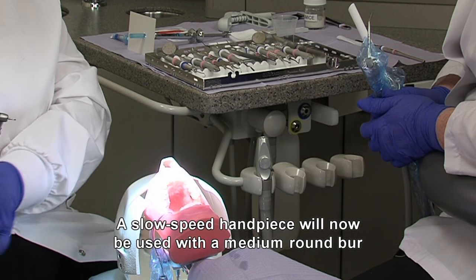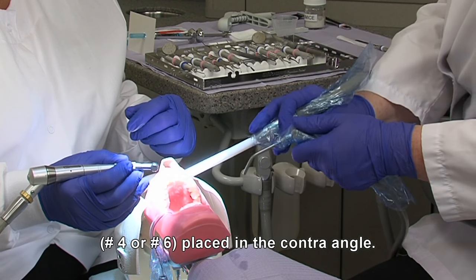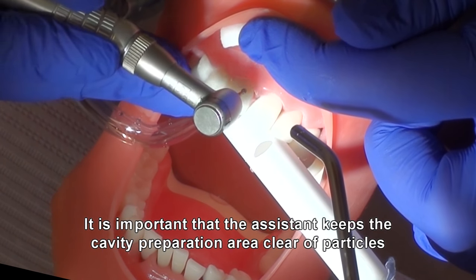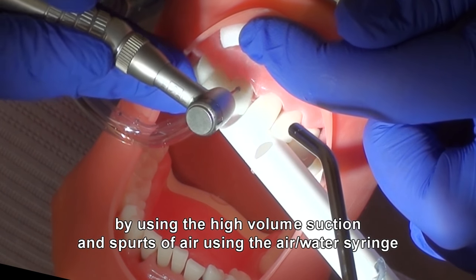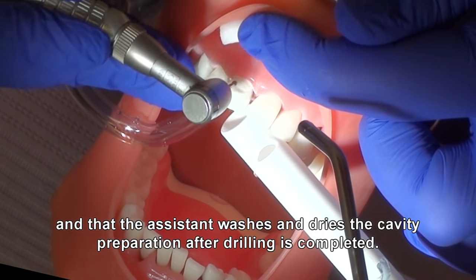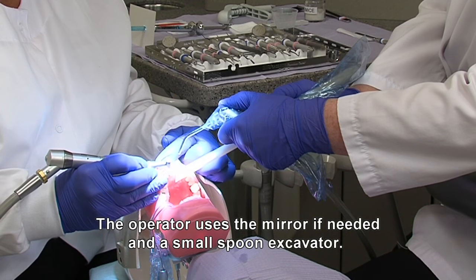A slow-speed handpiece will now be used with a medium round burr, number 4 or number 6, placed in the contra angle. It is important that the assistant keep the cavity preparation area clear of particles by using the high-volume suction and spurts of air using the air-water syringe, and that the assistant washes and dries the cavity preparation after drilling is completed. The operator uses the mirror if needed.